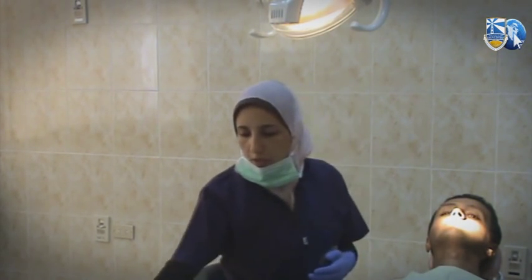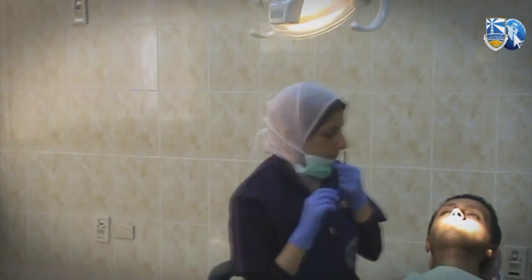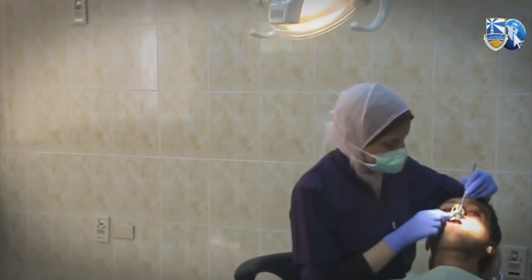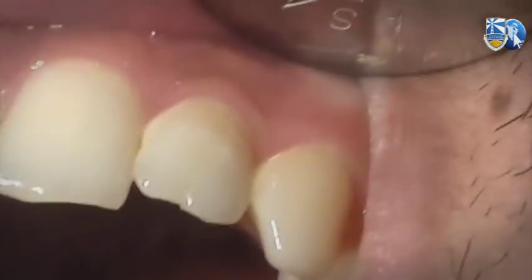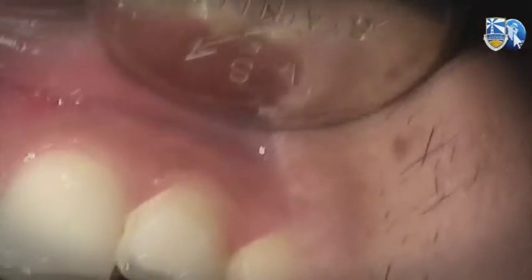Let's see the normal color on the patient. This is typically a normal color of the gingiva. This is the pale pink color.